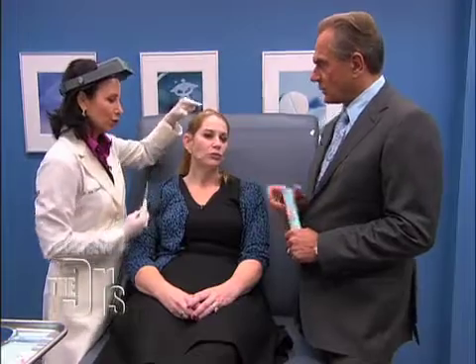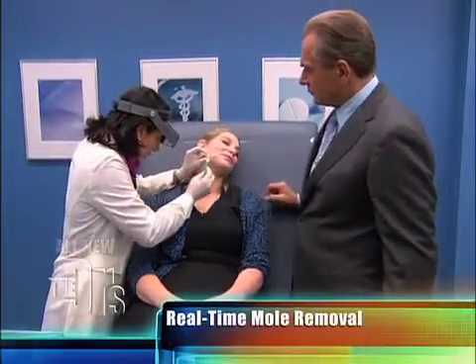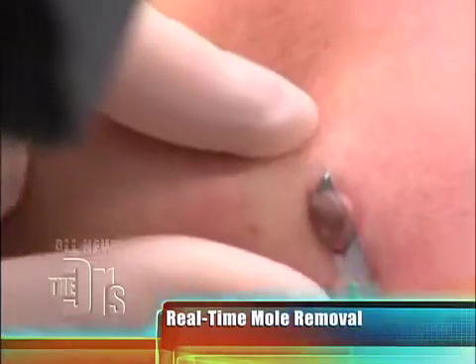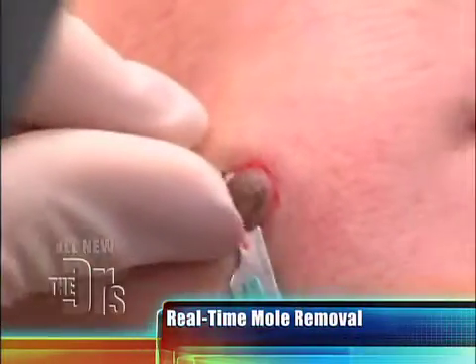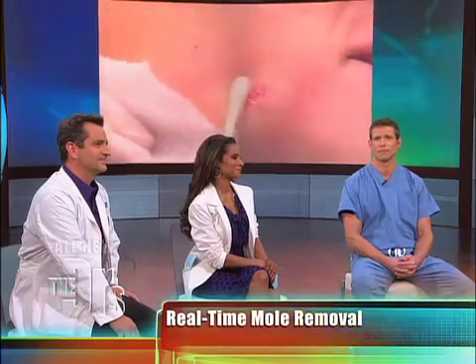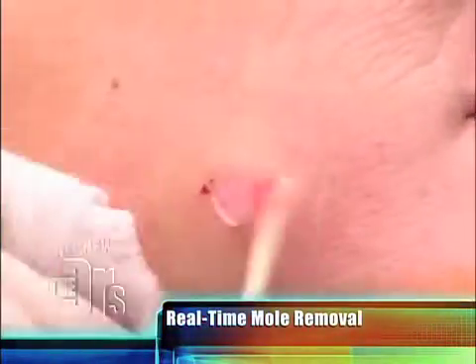So here we go. Jill's already numb, she's already prepared. Say goodbye to the mole. That was quick. As Dr. Shamban said, level with the skin — absolutely level with the skin.